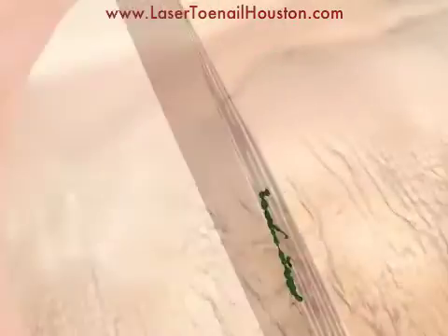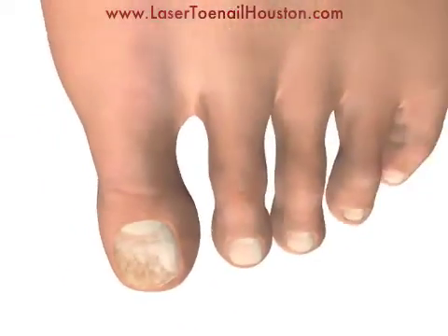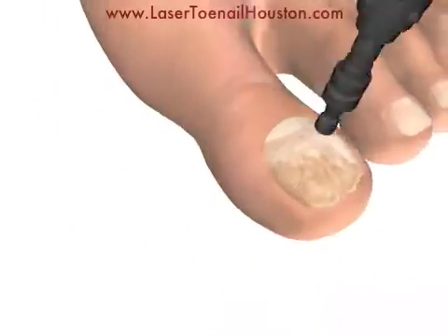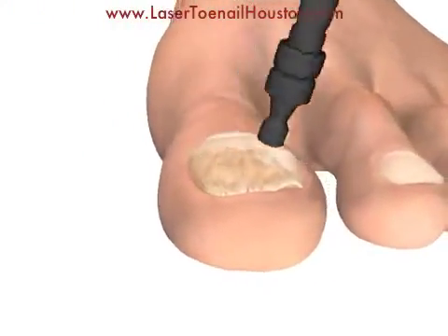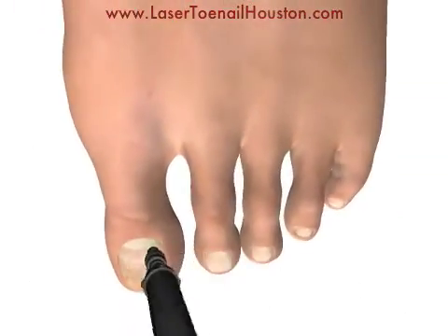This makes the toenail thicker and causes the ugly discoloration you see on the surface of the toenail. To treat this, your podiatrist moves the laser back and forth across the surface of the toenail in a grid pattern in order to destroy all of the fungus that is infecting the toenail.